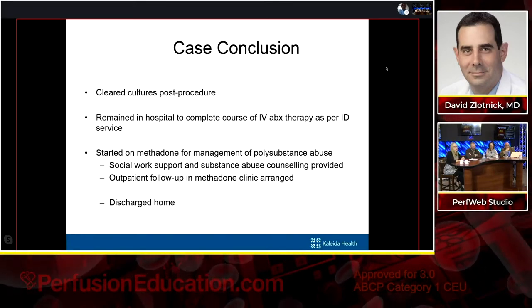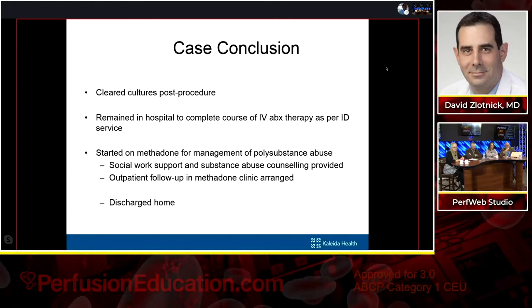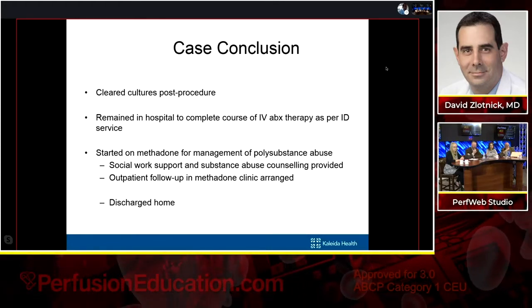So this is the filter afterwards, and these are the multiple frond-like vegetations that we were able to get after we debulked. And I'm going to show the post transesophageal echo picture. So we were able to debulk about 90% of the vegetation. All we had left was just that linear vegetation. So we deemed this to be a very successful AngioVac.